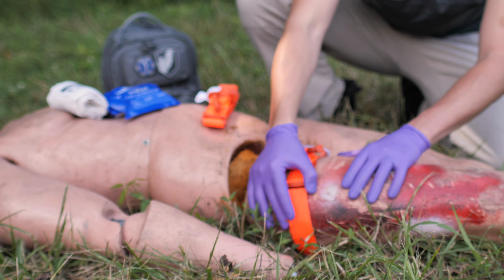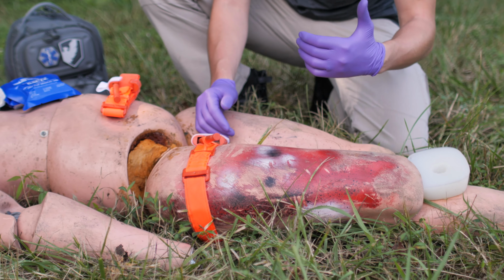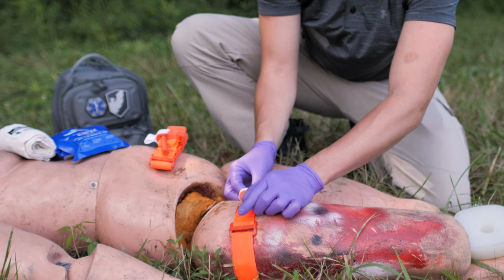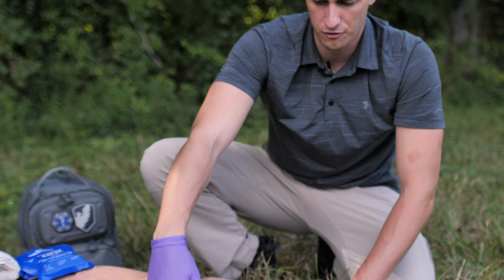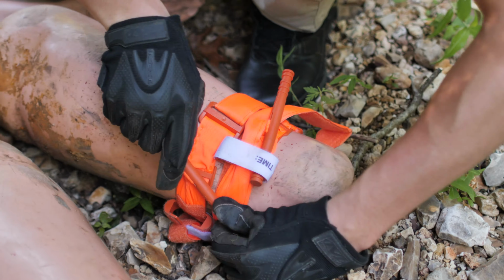So we'll check to make sure it's tight enough, check to make sure wherever it was bleeding has stopped. If we need, we can come in here and tighten this up. So come in here and crank this a little bit until the bleeding stops. If we have to, we'll apply a second tourniquet so we can apply that right next to the first tourniquet that we've placed. We'll offset those windlasses so that we can still crank them down.